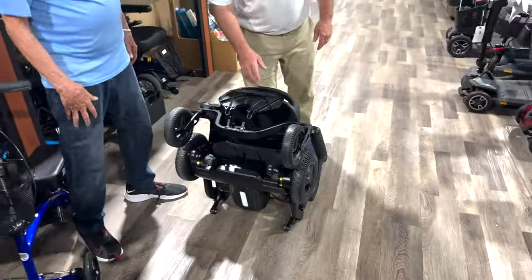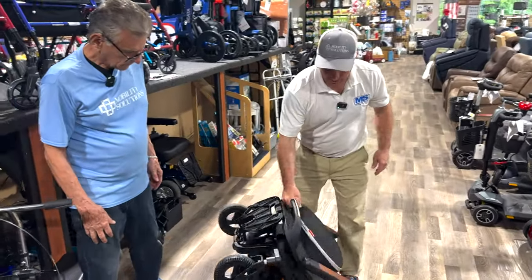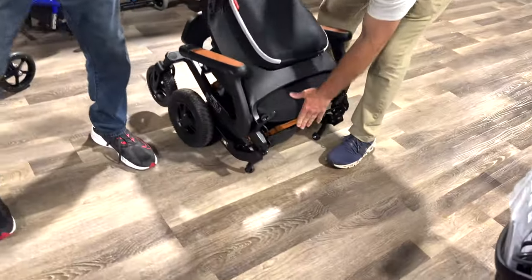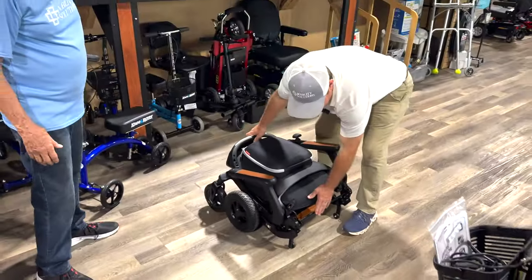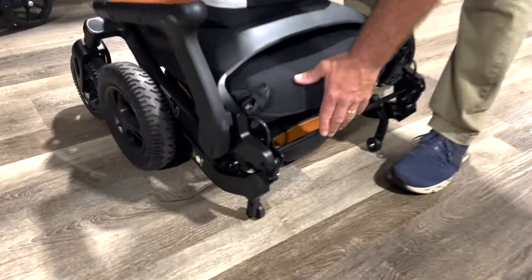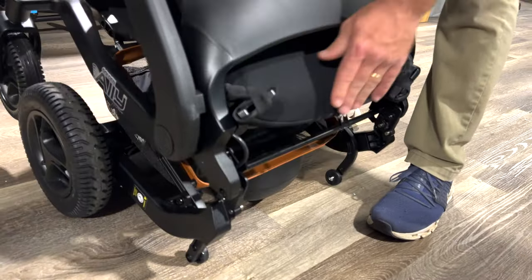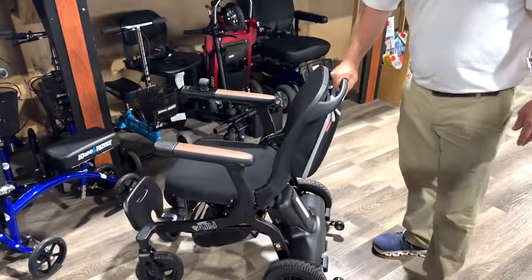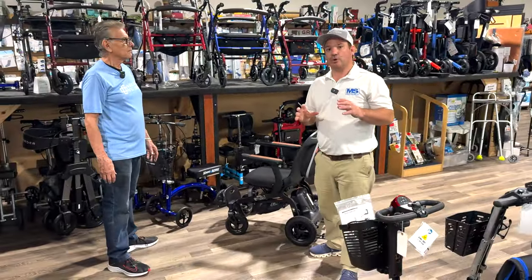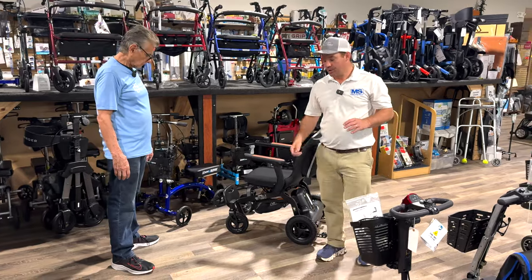We're going to get you a rundown real quick of the specs. Now to unfold this, just come down. This is a little latch. You push down and then you just bring your hand. So a little latch right here. Zoom in real quick for me, Scotty. This here, and then just bring it up. So that could be a little heavy for some people. You'll get the hang of it.